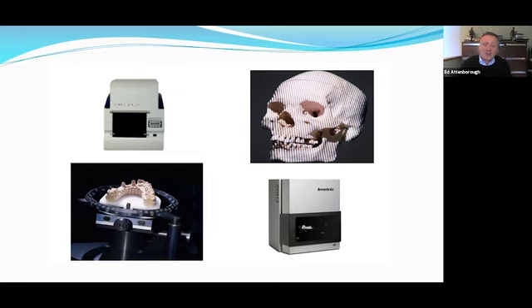So we saw in late 2007-8 that these technologies started moving, certainly in the lab scanners, which didn't need color information, to a monochromatic source of light, and they settled at that time pretty much universally on blue light. However, you can still do a multi-scan where you scan with blue light for an accurate scan and then quickly expose in white light to capture color information, which can be overlaid.